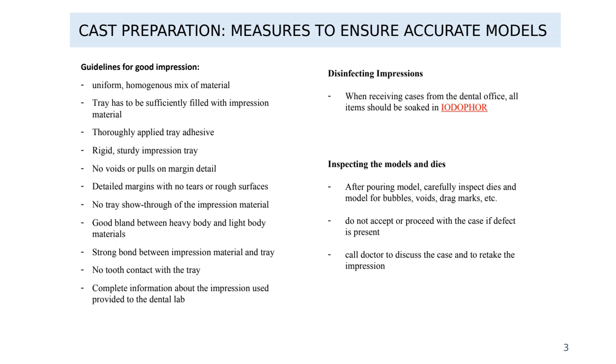Disinfecting the impressions. So when you're receiving the cases from the dental office, all items should be soaked in iodophor. Okay, so make sure you disinfect everything that comes. The bite registration, and if the doctor also sends you the face bow, that should be disinfected. Everything has to be disinfected.